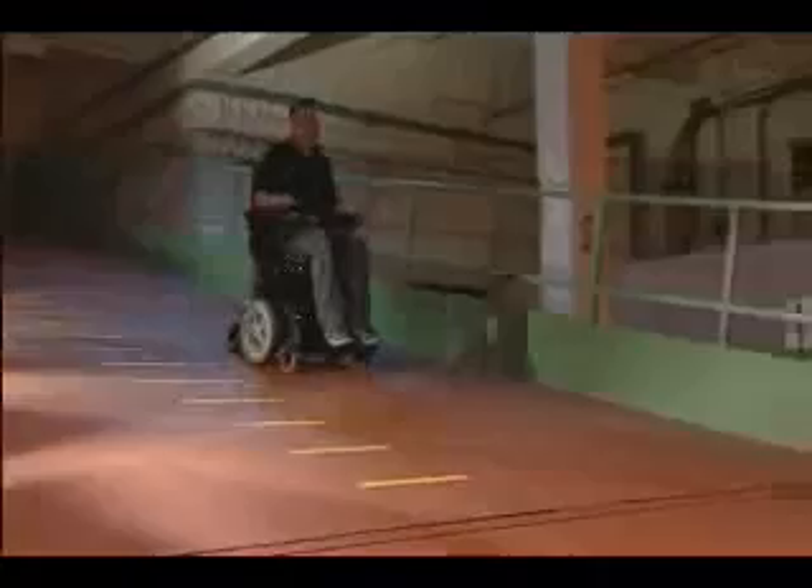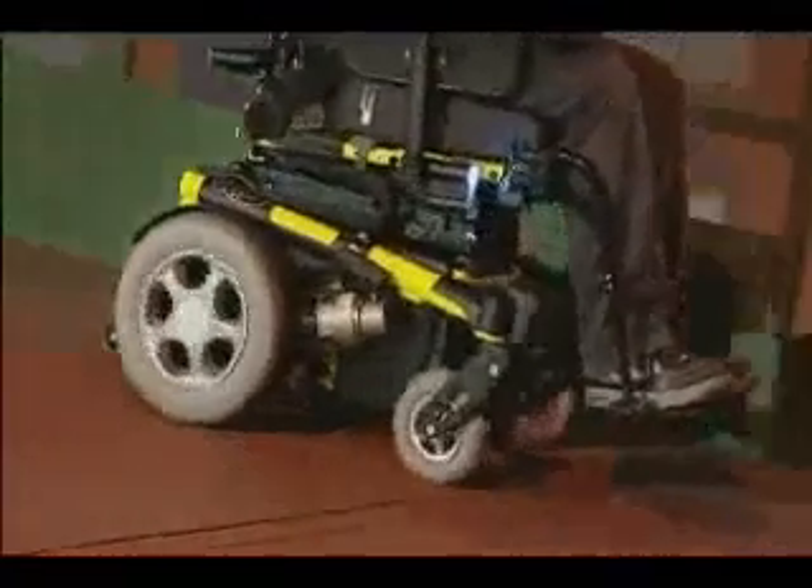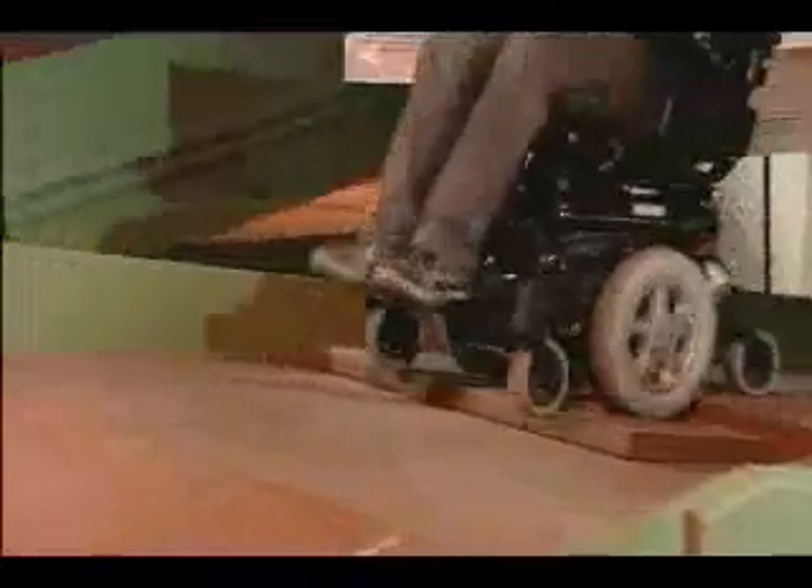Our indoor ramps are used to test the anti-pitch system when braking on a steep incline and also show the reversing capabilities of our rear wheelchairs. Rigorous testing shows the true potential of the mid-wheel chair as it turns with ease on the apex of a hill.